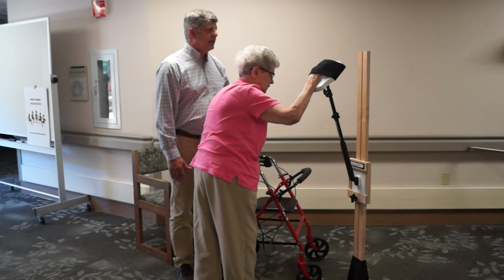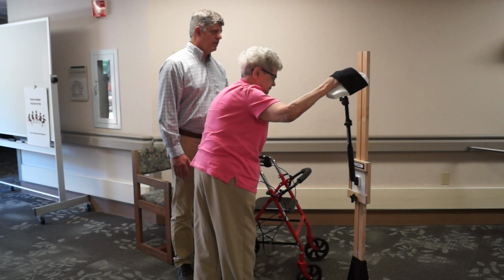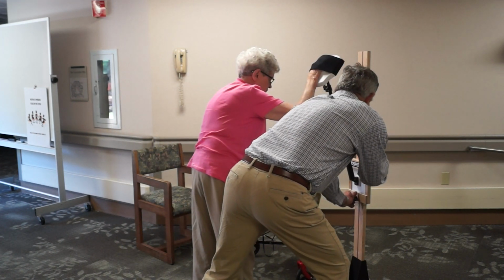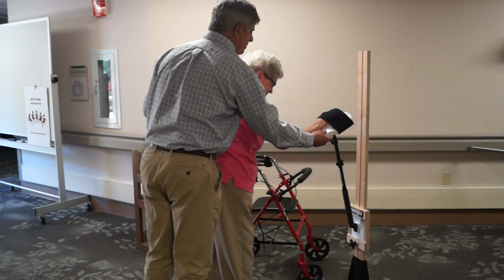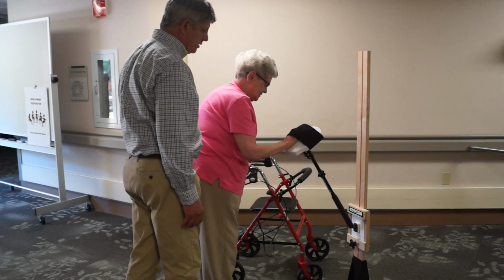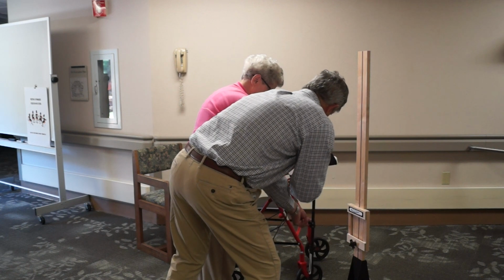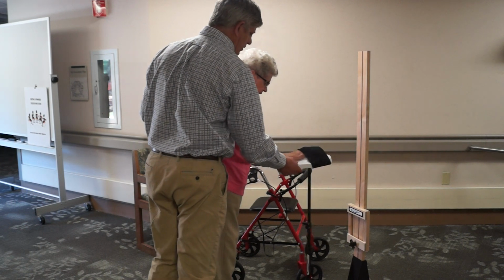Okay. Go ahead and reach again and look up where you're going. Good. Come back. And then just reach a little bit of an angle out that way. Okay. Beautiful. One more over here and we'll take a break. Oh, very good. Let me bring you down. Nice work. That's your best. That's your personal best. Okay, so let's go just back and forth a couple little ones again, just to end with. And then I'll bring you back on the ground. And then this will let you just relax, okay? Just go back and forth a couple easy ones.